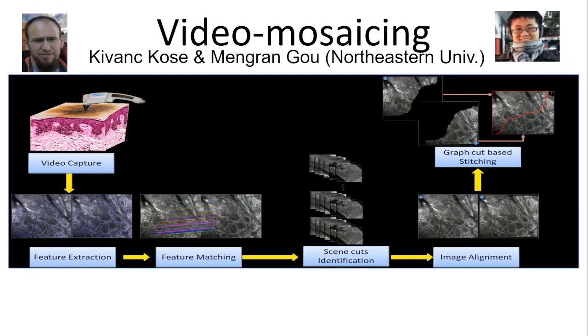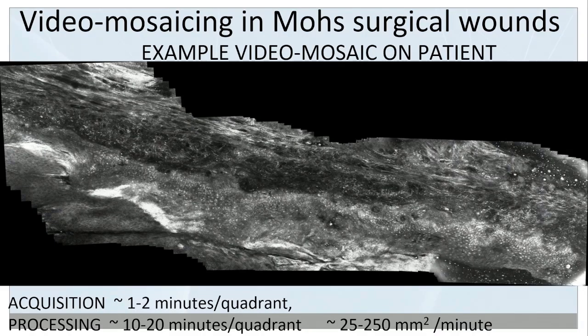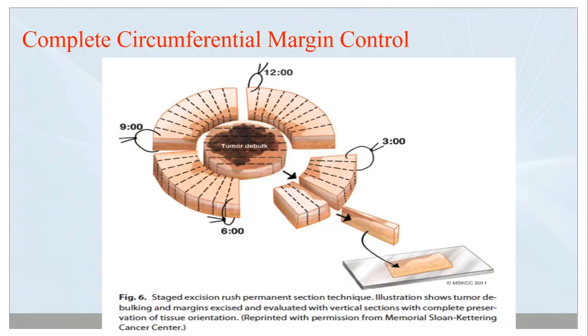And then to further whet your appetite for these imaging tools, our optical engineering team came up with video mosaicing. So really stitching together these images that are captured in video format in a panoramic way to give you sort of this elongated view of the skin. Similar to what Dr. Tierney showed with his OCT, seeing a long field view of the intestine, we can do this with the skin as well in a very fast amount of time.